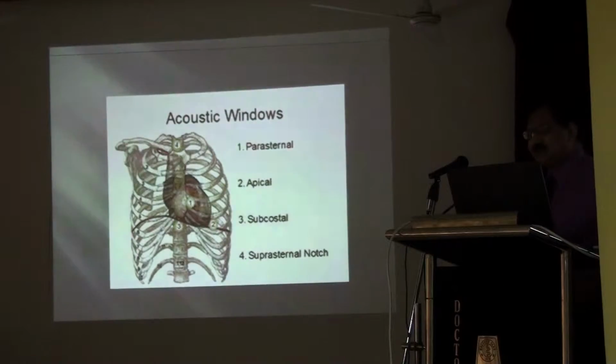But what we are practicing is clinical echocardiography, where we want the outcomes of patients related to common data. So two views are enough for most of the information: the parasternal view and apical views. But if there is ASD or any pathology related to blood, we have to go for the subcostal view, and for information related to the aorta, we have to go for the suprasternal.